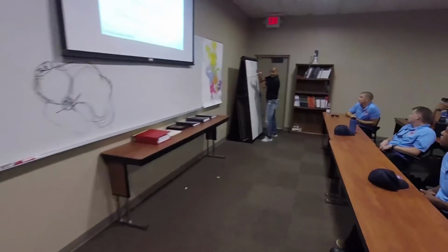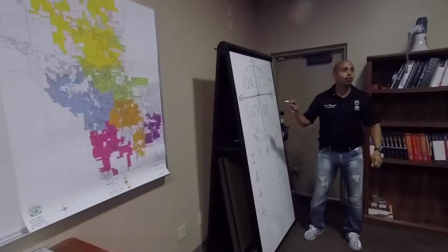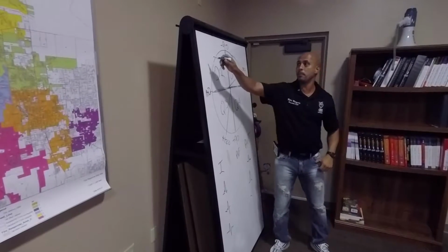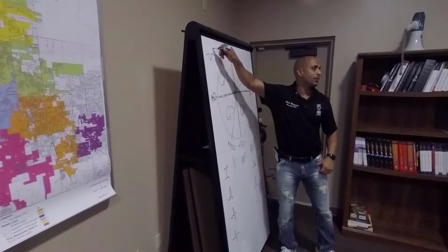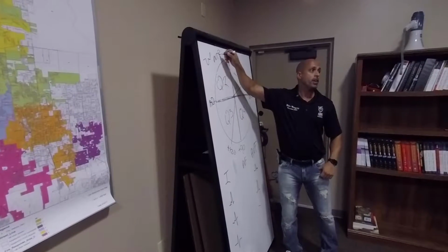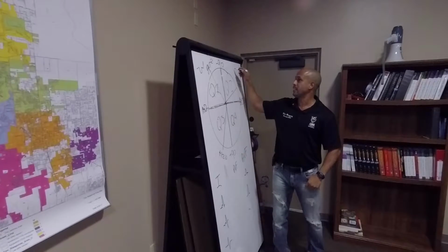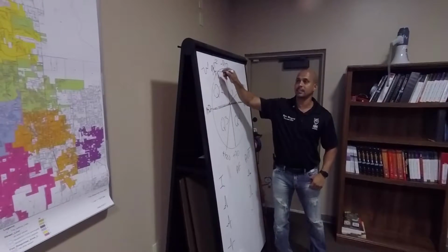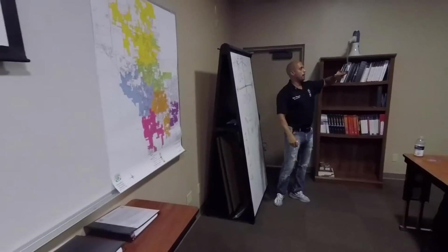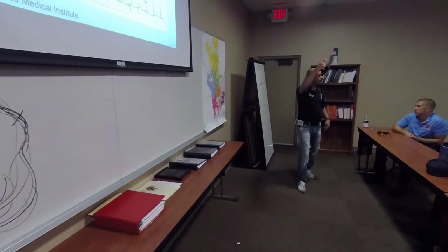I reverse my leads, right? I reverse my leads. So I go to lead 1. My P wave, if I put it backwards, is going to be upside down. And the lead right next to it, which is AVR, AVR sits on the negative side, right? Now, because I switched my leads, this becomes positive, so my AVR P wave is upright. So in lead 1, my P wave is inverted, and in AVR, it's upright. Your leads are backwards.